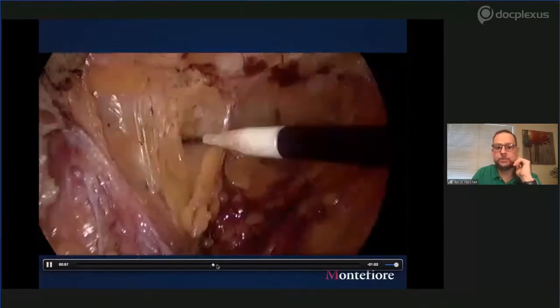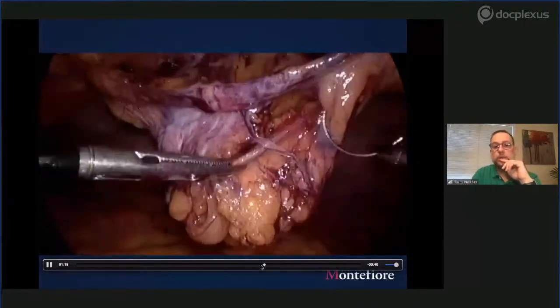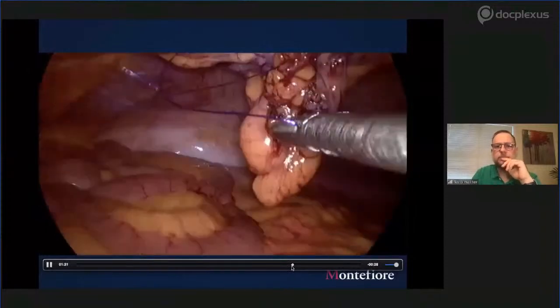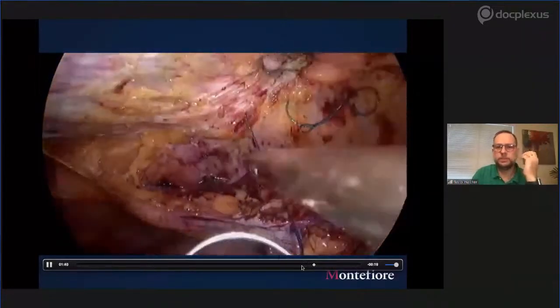It's the same surgery done by traditional laparoscopy. At the end, you need to close the defect and close the holes on the peritoneum. For this example, he got a big hole on the hernia sac itself. And then close the defect. It was, again, as in my example, a 2 by 2 centimeters defect.